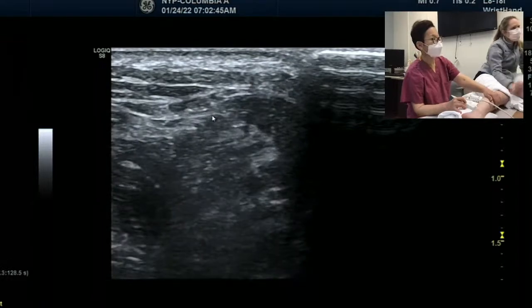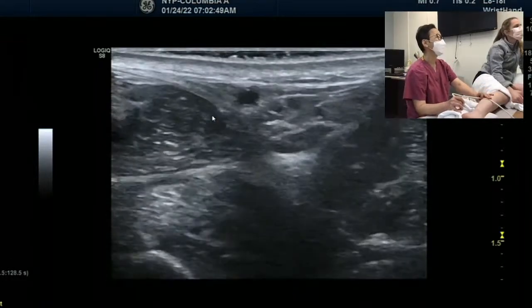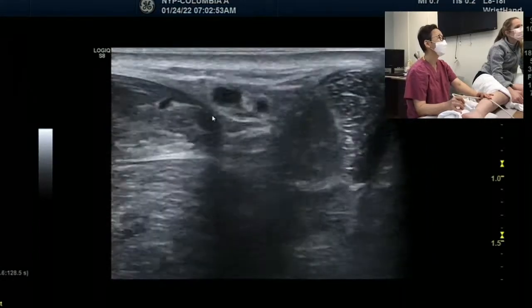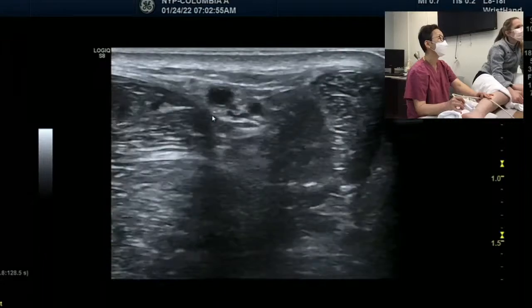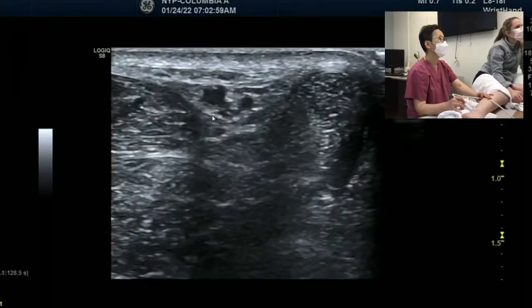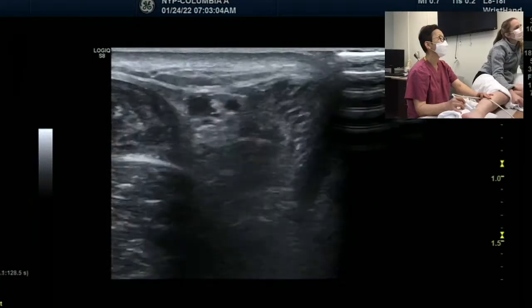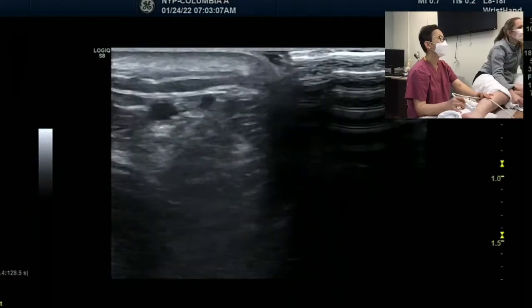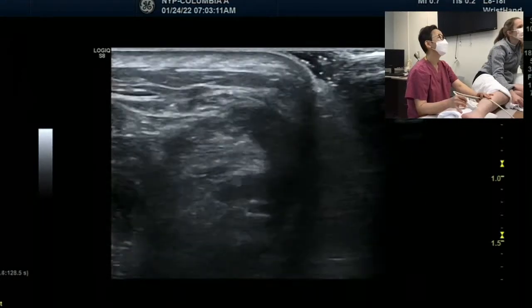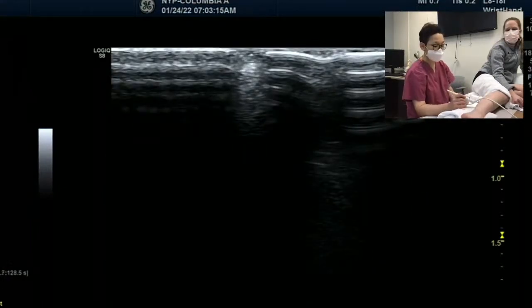Okay, one more time. So we're gonna do the ankle. If you're not so sure, just move around like this. And there's a consistently moving structure, right? Where the cursor is now, that area. Can you remove the cursor? Look at this. Now it's going into the adipose tissue, something is moving, right? Now Debbie is going to help us with the cursor.